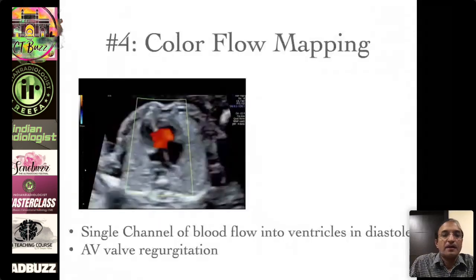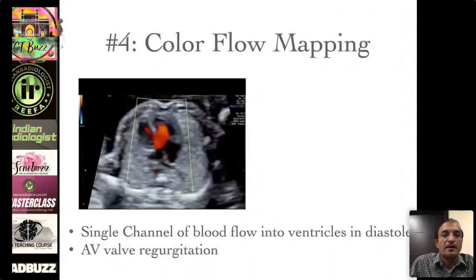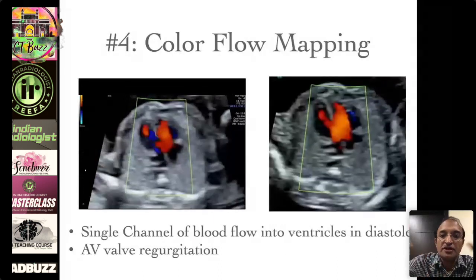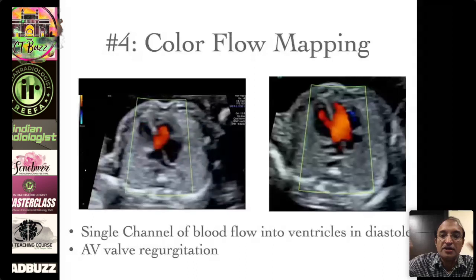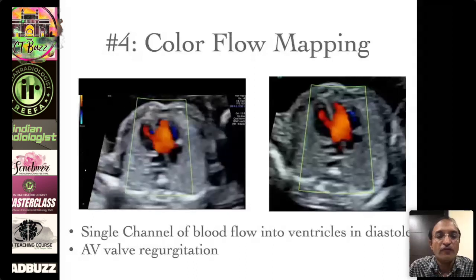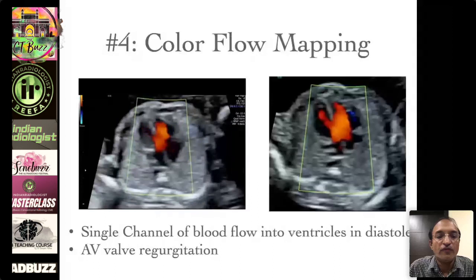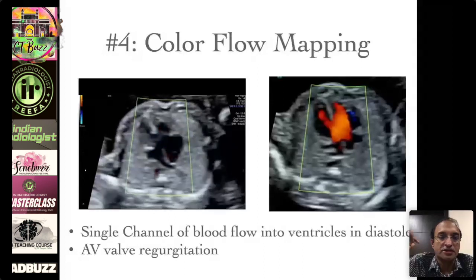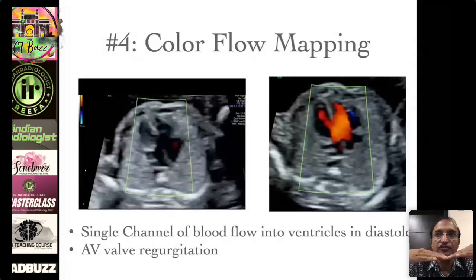The fourth feature is when you put color, you find a single channel of blood flow into the ventricles instead of two separate channels. As we can see in this movie, you can also make out some atrioventricular valve regurgitation. The two important imaging points: in the diastolic frame you find a large defect in the crux of the heart, and in the systolic frame you see the loss of offsetting or the linear insertion.